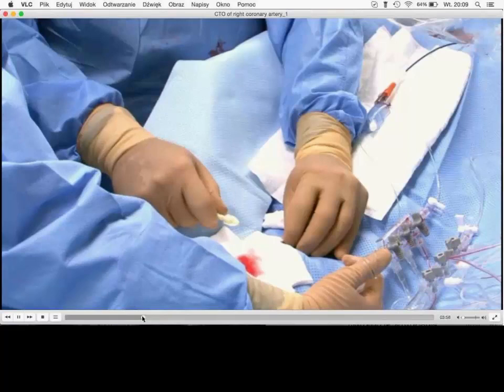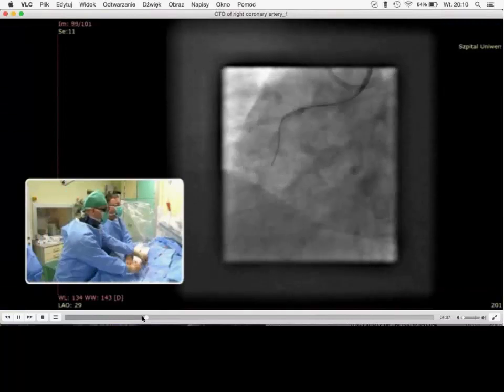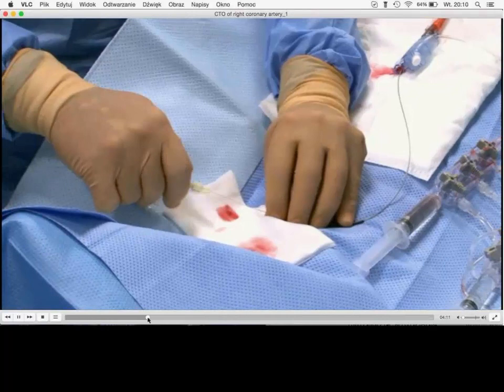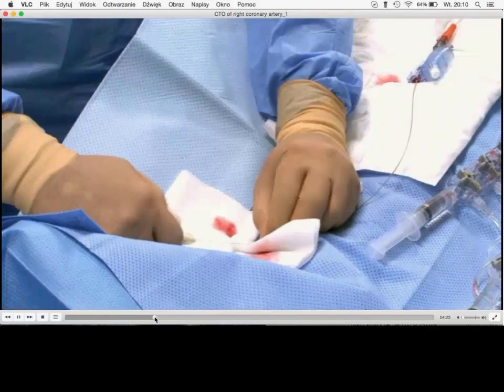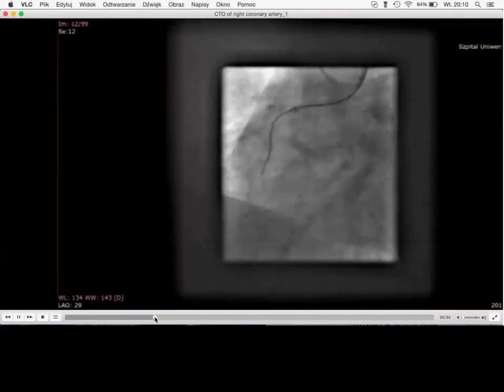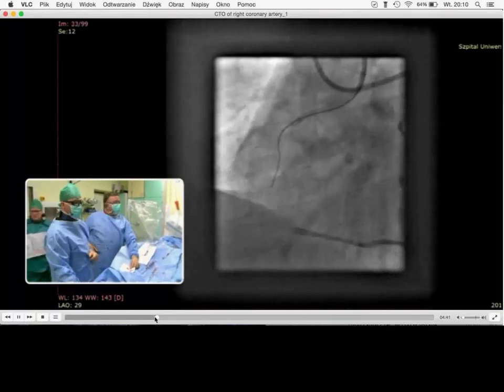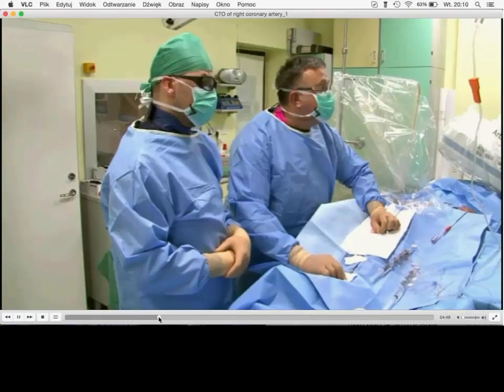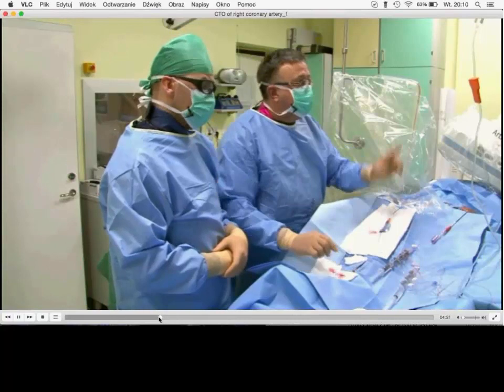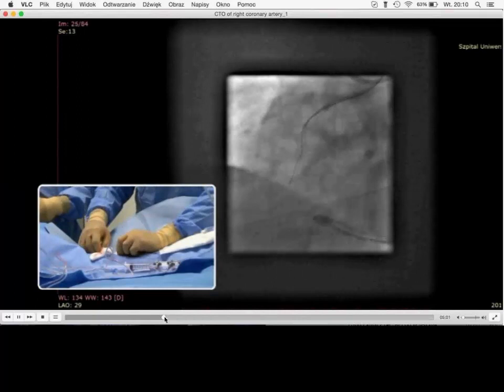You see how the wire is knuckling within the artery, and I was outside of the vessel architecture. This is the maneuver with the wire, and you can see here clearly that the wire is outside the vessel lumen. It's the Confianza wire that you have now. The final one was the Confianza wire. You see, it's another position. So we decided to switch to retro.